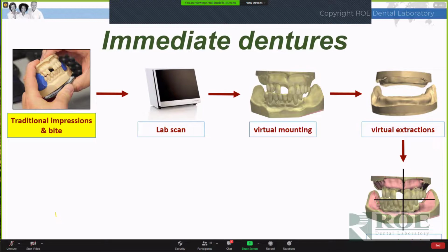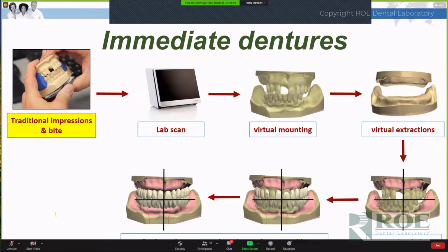And very important again is to evaluate the patient's existing teeth before they're extracted. Midline, incisal length, all the things we just talked about. Same thing, just evaluate it. Jot down some notes so that the laboratory knows where to start, where the midline, incisal length, et cetera are. We use that and we ghost in this information at any time, using the existing teeth as a reference to help guide the process through the design. What an opportunity. We just don't have that with our traditional flow.